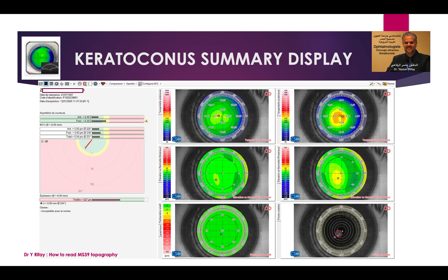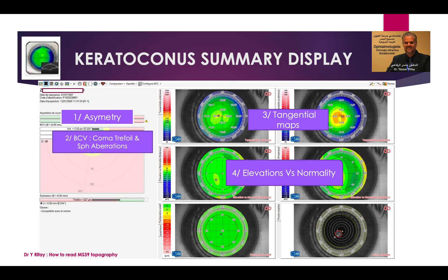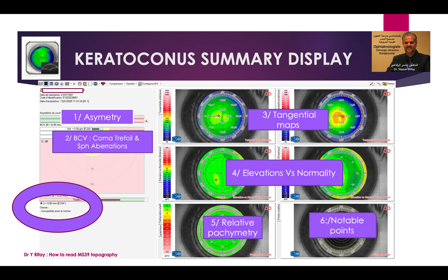The keratoconus summary display is an artificial intelligence tool to help us diagnose keratoconus and ectatic corneal diseases. It will study the asymmetry of the tangential maps, the BCV, coma, trifol and spherical aberrations, tangential maps, anterior and posterior elevation maps compared to normality. The reference surface is not a best fit sphere but a normal cornea surface. It also studies relative pachymetry map and notable points, and the conclusion can be normal, abnormal, keratoconus, or others.